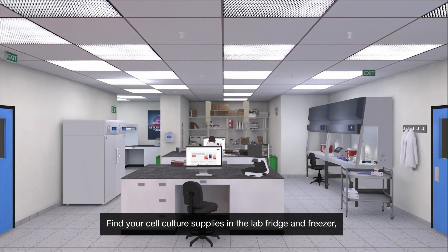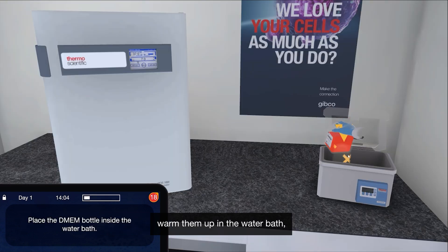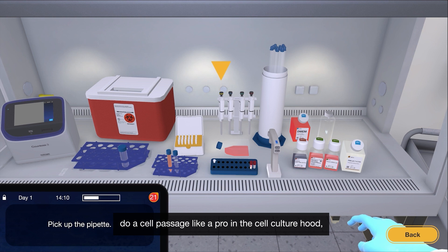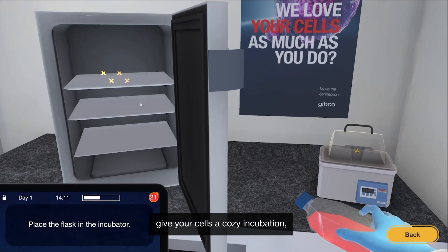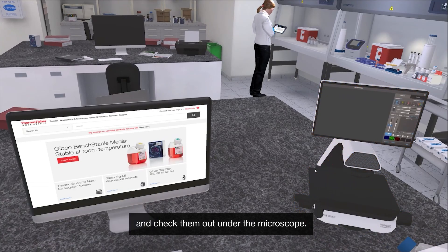Find your cell culture supplies in the lab, fridge and freezer. Warm them up in the water bath. Do a cell passage like a pro in the cell culture hood. Give your cells a cozy incubation. And check them out under the microscope.